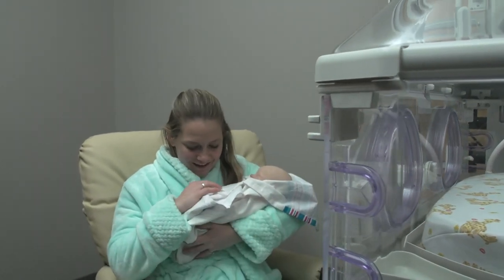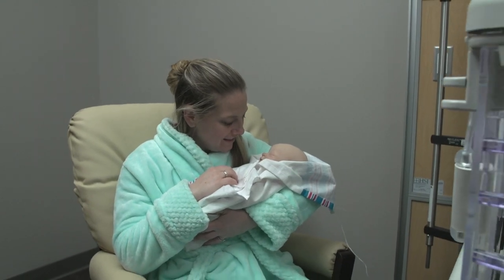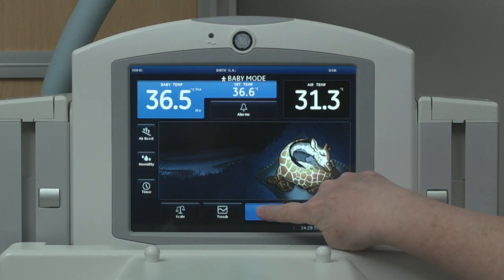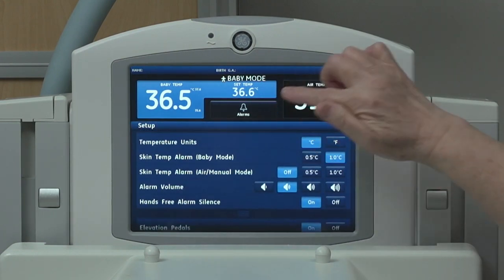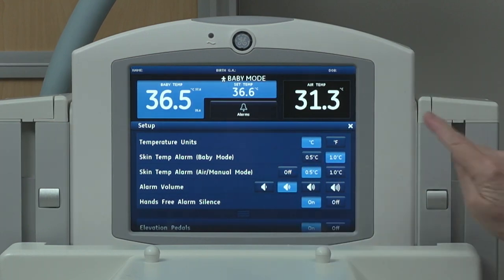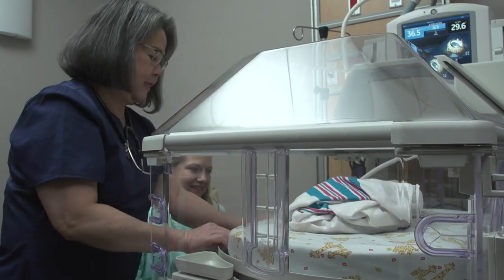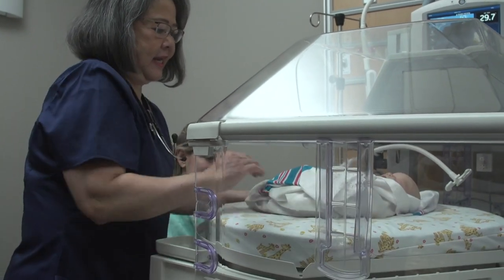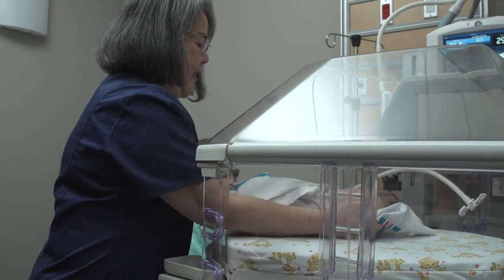When doing kangaroo care, maintaining the baby's temperature is important. Here's how to set up temperature alarms: press Setup, scroll to Skin Temp Alarm, and remove it from off by selecting 0.5 or 1 degree Celsius. This will set the alarm compliance limit at either 0.5 or 1 degree Celsius.